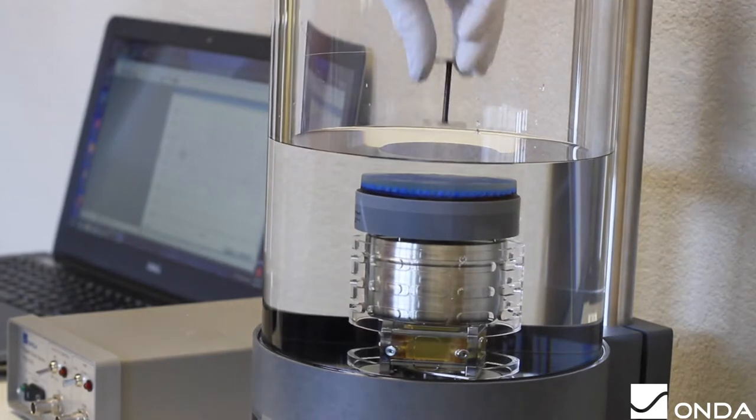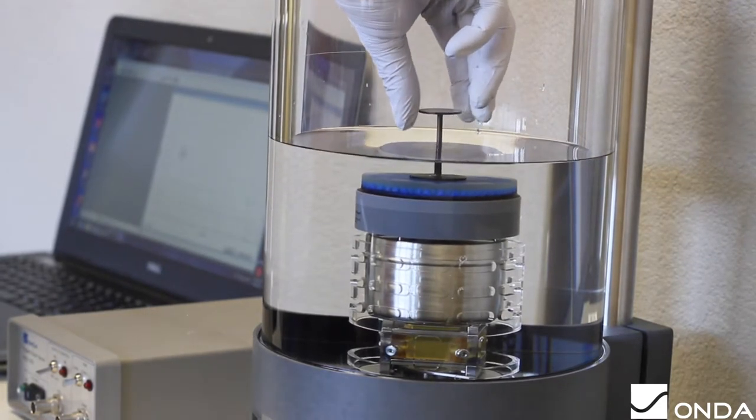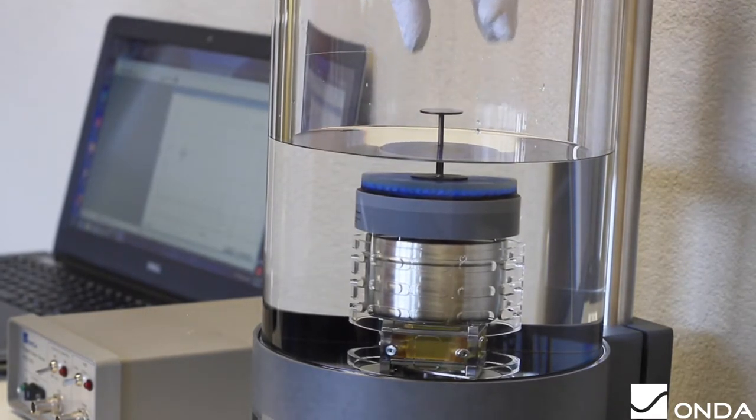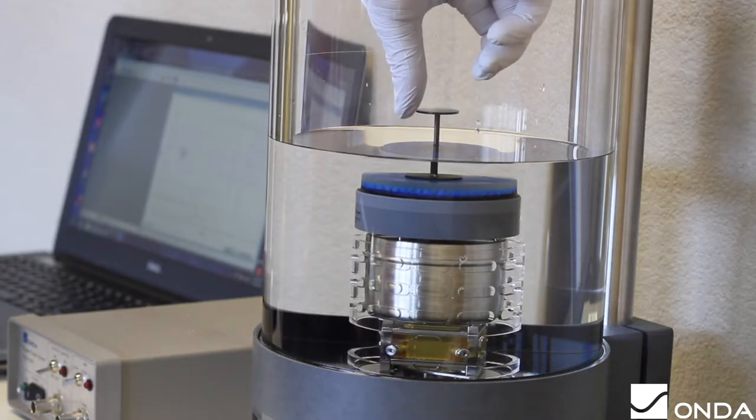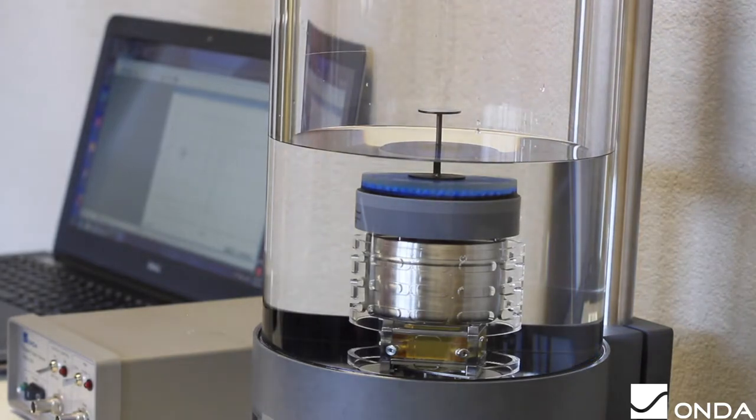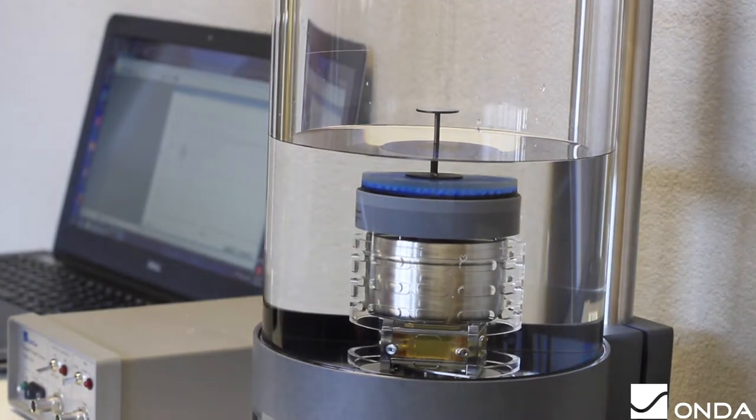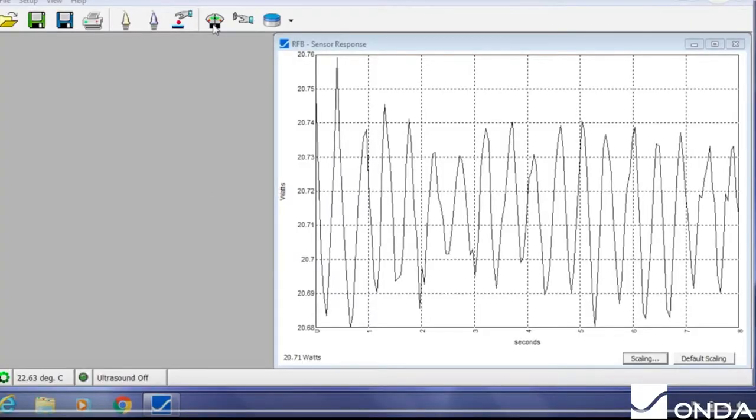To calibrate the RFB-2000, place the plastic stand vertically on top of the sensor so that half of the stand is above water and the other half below. This will allow the user to apply the calibrated standard weight to simulate a constant ultrasound power.